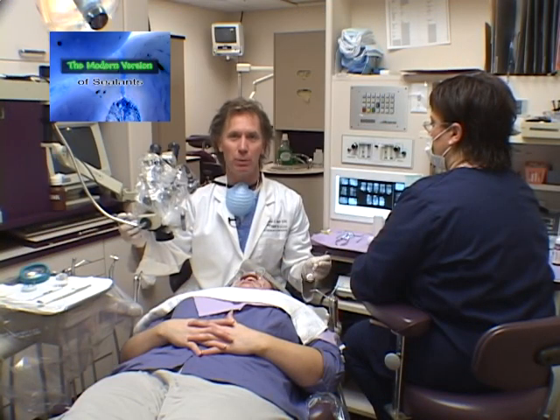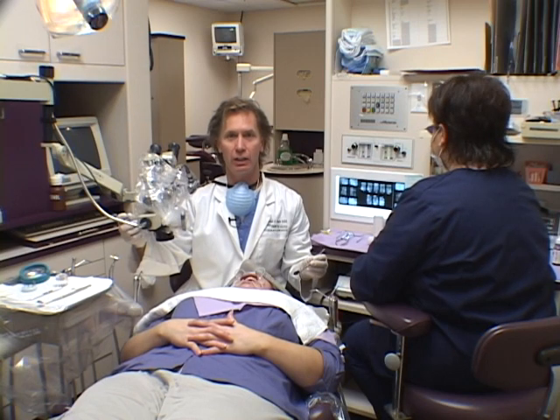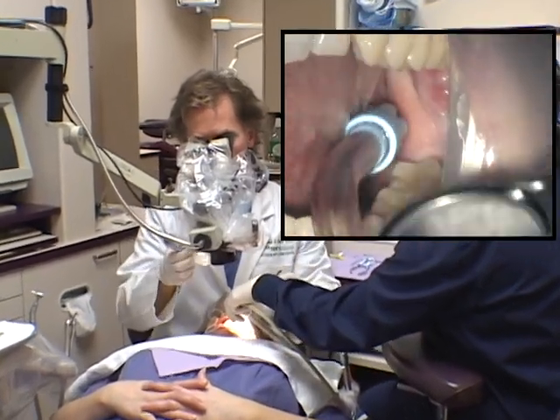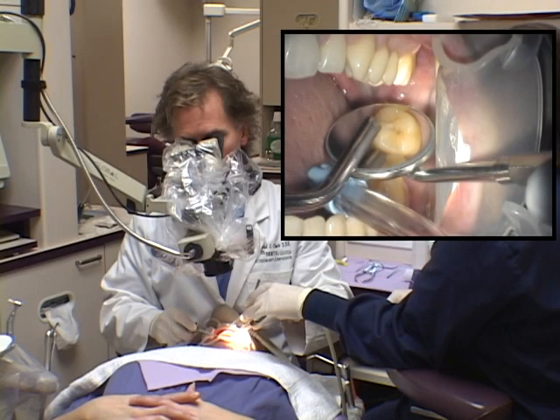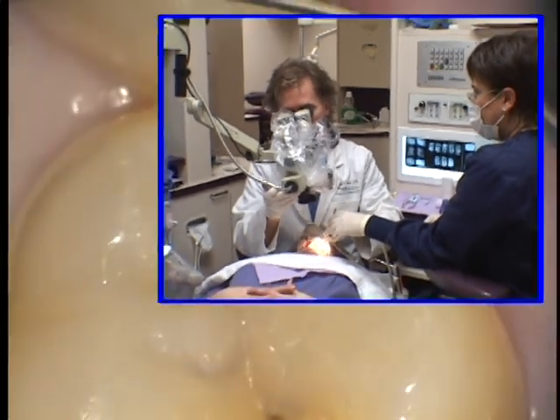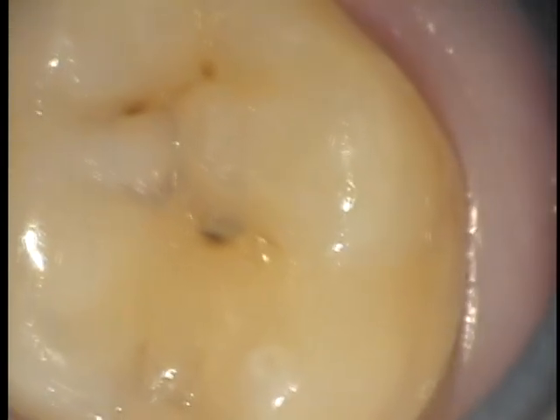Merrick presents with teeth number 14, 15, and 18 that are unrestored with varying levels of decay. We'll go in with the operating microscope and do a cursory examination, place a rubber dam, and then restore the teeth as indicated. At low magnification, we see a slight discoloration on the occlusal of number 14. As we move up through the levels of magnification, we see some interesting patterns of darkening.